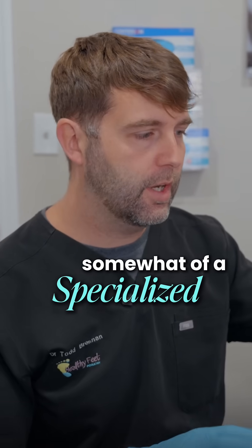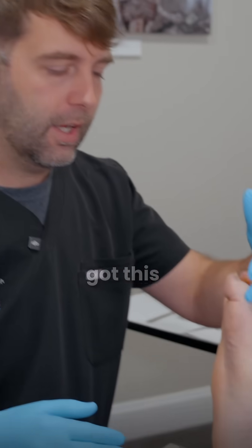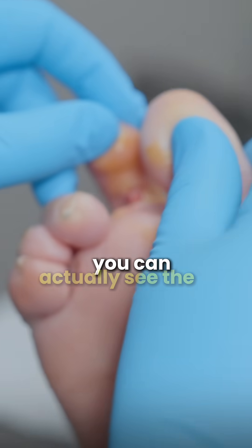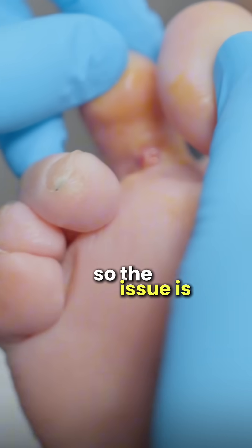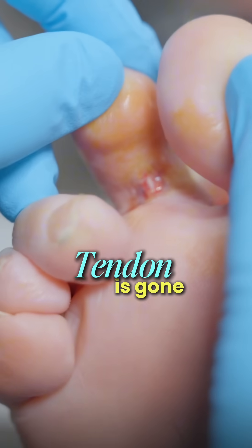We're going to do a somewhat specialized procedure today for this toe that won't heal. You can see she's got this deformity here where the toe drifts and then the second toe pops up. You can actually see the tendon. The issue is this wound will not heal until that tendon is gone.